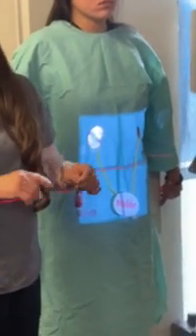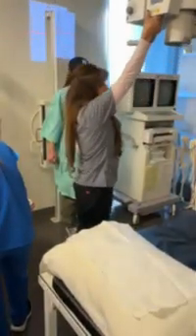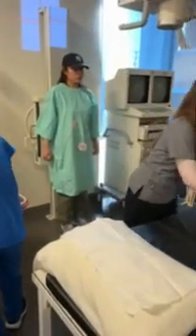Still put timer marker on the post void, or no? Not on the post void. Usually it's when you're looking at the contrast, especially before the post void. All those images you label, you put markers. Now, let's say the doctor says no, still I don't see contrast in the bladder. Give me a supine to see if that helps to push some of that contrast.